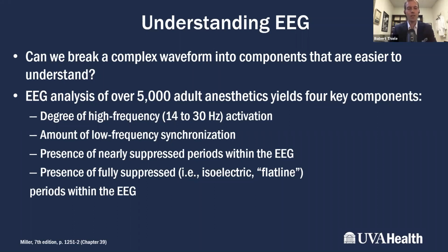And so different companies have developed processing strategies to try to break down this complex signal into something that's usable and easy to understand, but that gives you meaningful information. The Bispectral Index, as an example, is based on a large data set of patients undergoing general anesthesia, in which 4 components were extracted from these signals that seemed to have relevance in terms of depth of anesthesia.